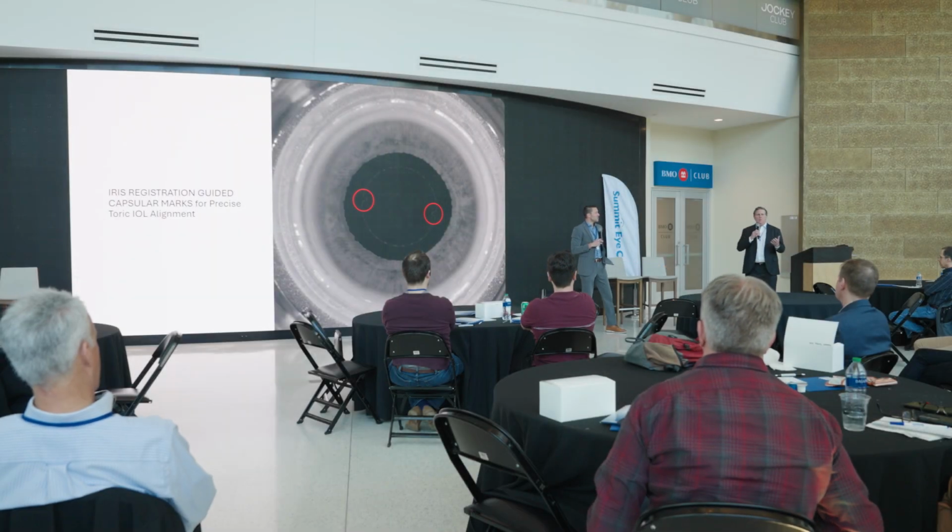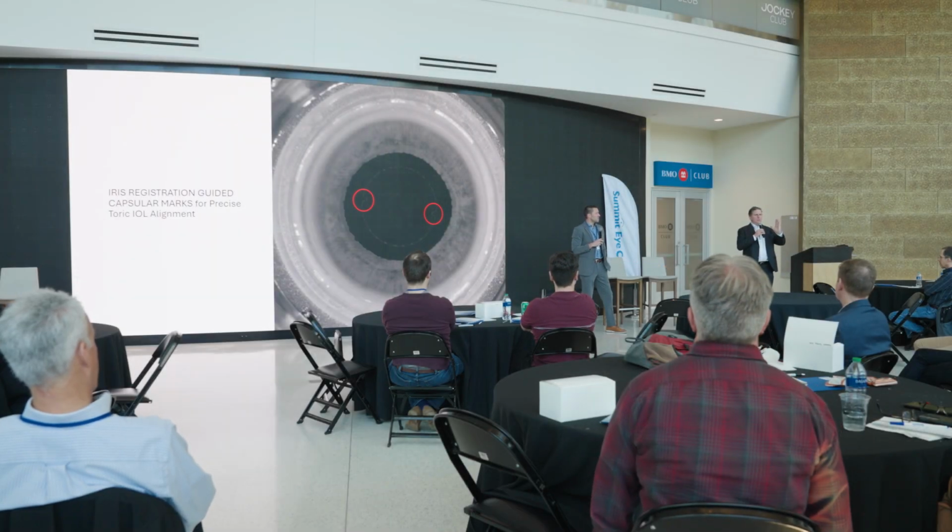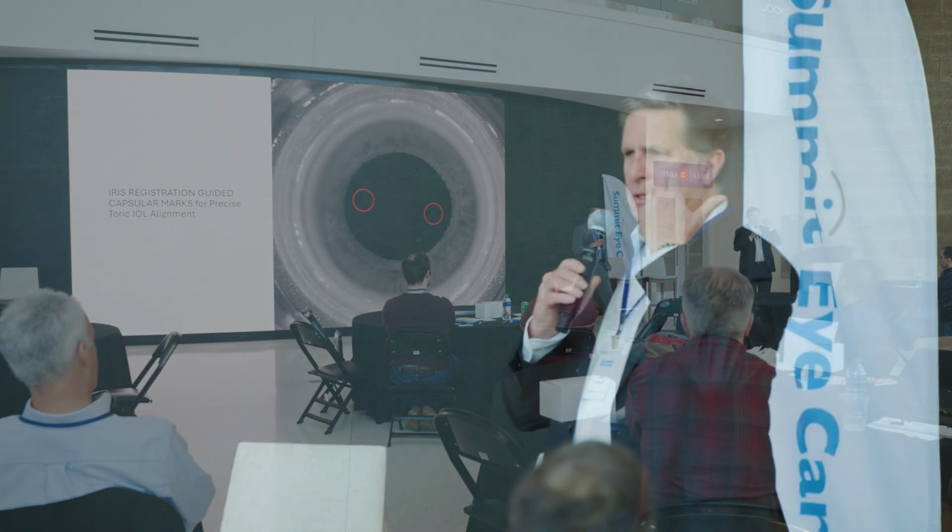Previous to this, we would have the patient sit up. We would anesthetize the cornea, use a skin marker, and try our best to identify the 12 o'clock and 6 o'clock meridian. That gives us a reference point. We then lay the patient down, and there's often cyclorotation after they lay back. We then use something called a Mendez ring. We try to line that up, and then we put a mark where we want it to be.